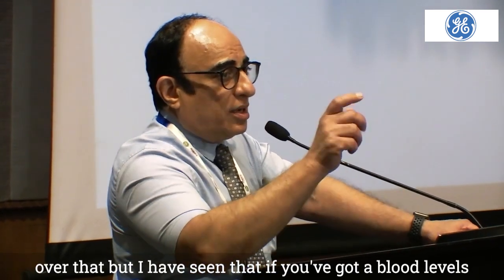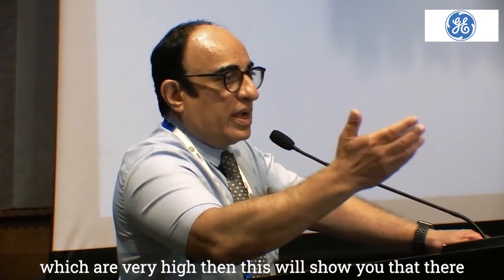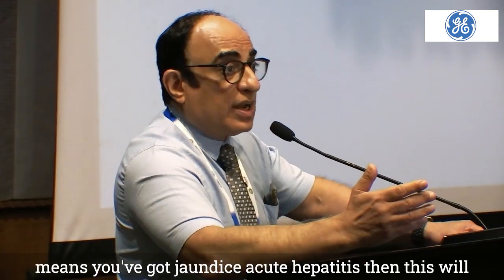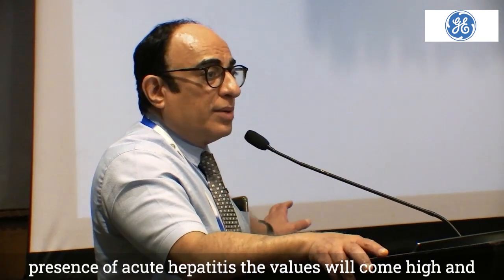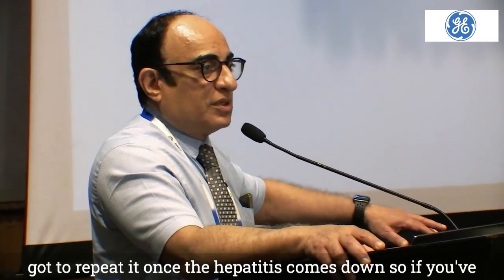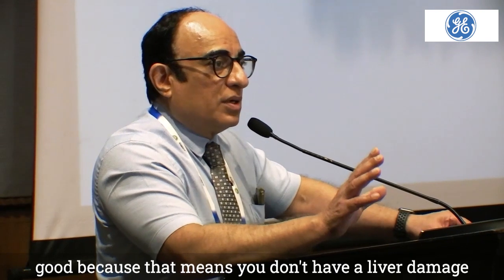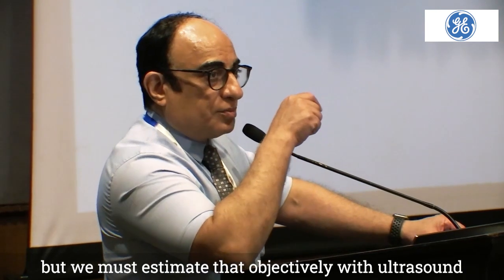But I have seen that if you've got blood levels which are very high, then this will show you that there is NAFL, NASH. So it will show you the values. At the same time, if your values are very high, that means you've got jaundice, acute hepatitis, then this will also show you slightly higher values. So we know that in presence of acute hepatitis, the values will come high, and you've got to repeat it once the hepatitis comes down. So if you've got fatty liver and you've got normal values, I think that's good, because that means you don't have a liver damage. But we must estimate that objectively with ultrasound.